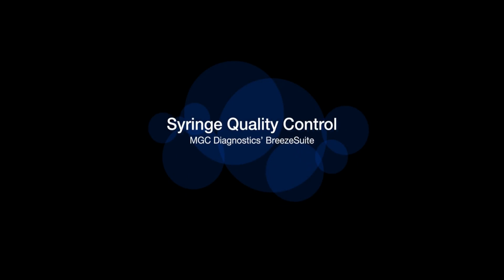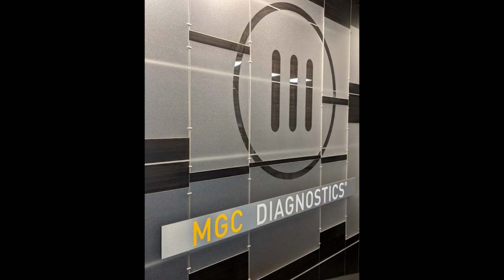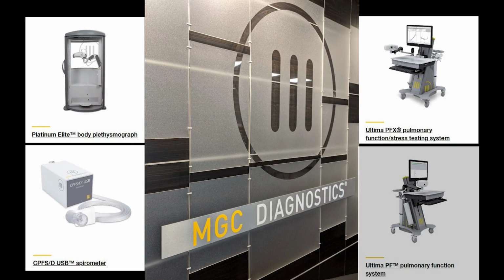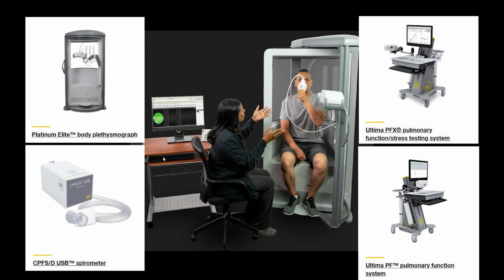In this video, we will show quality control for MGC Diagnostics Pulmonary Function systems using BreezeSuite software. Quality control is important to ensure that the laboratory is consistently meeting appropriate standards. Quality control testing involves periodic testing of a system to verify that it is within the manufacturer's specifications in order to ensure consistent and reliable results, which will help to reduce or eliminate errors.